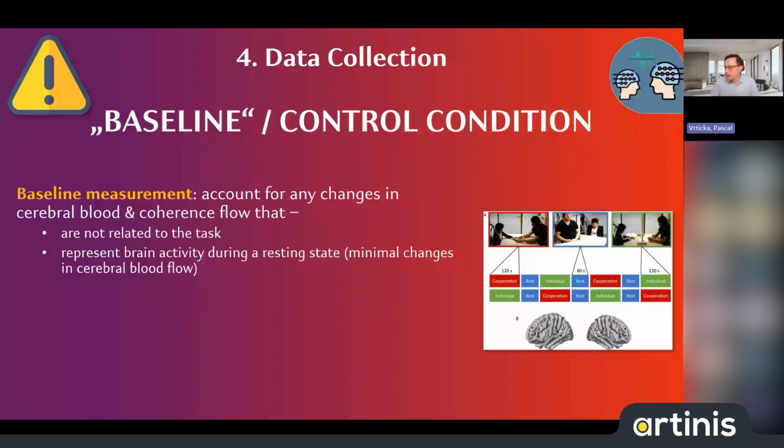What is important here, of course, if people come from the EEG field and transition into fNIRS hyperscanning, is the fact that in fNIRS hyperscanning, as we usually also do for fMRI, we don't really have a baseline, right? So we don't, for example, remove some data before an event from our event-related potential.